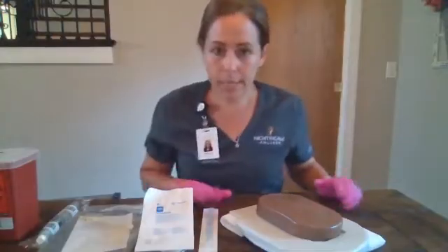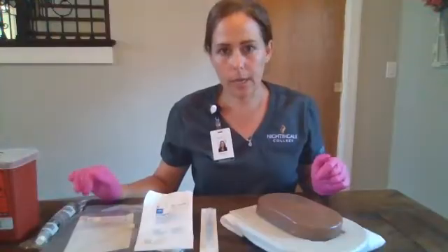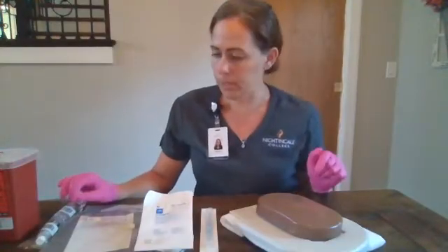I'm going to gather my supplies. I have my catheter, my IV start kit, my extension tubing, and a non-expired normal saline flush.